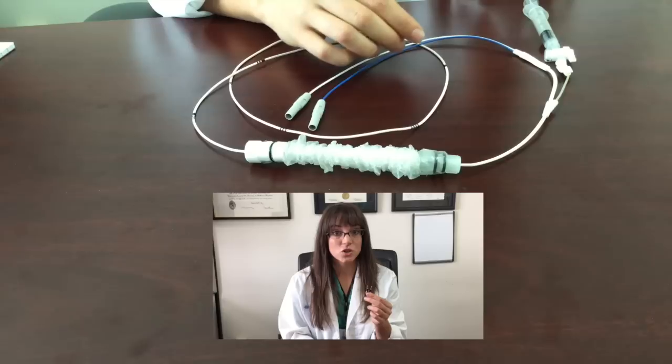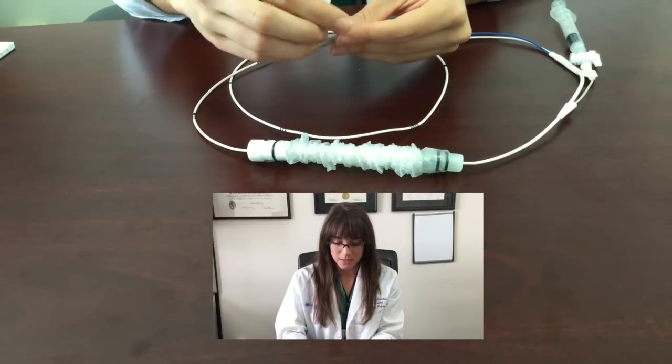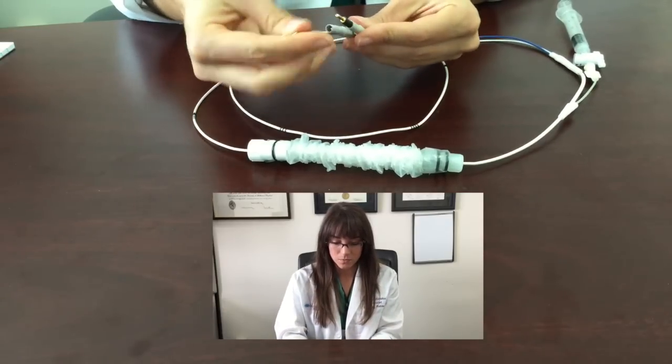The next step is very important. These are the pins. They are in the kit and they are in a separate wrapping when you first open up the kit. Don't lose them. What you are going to do is take the pins and place them into the grey tips.